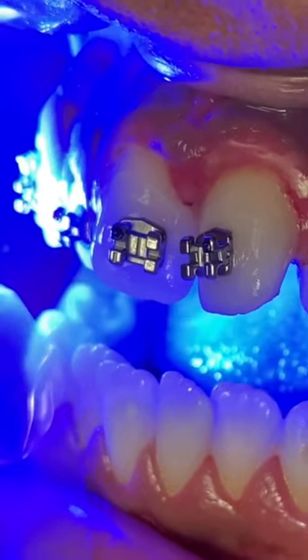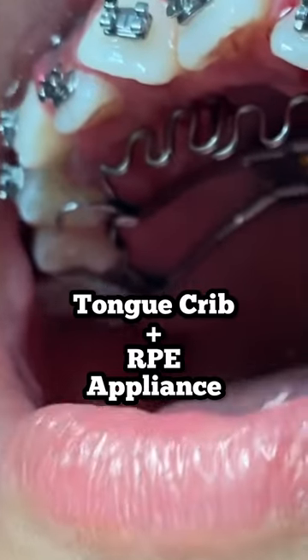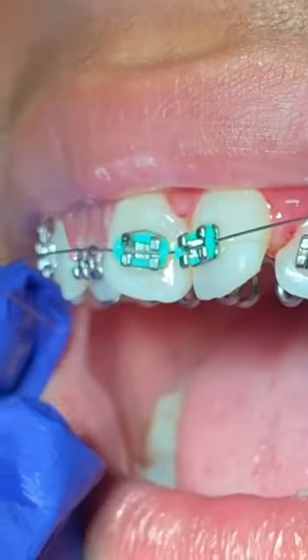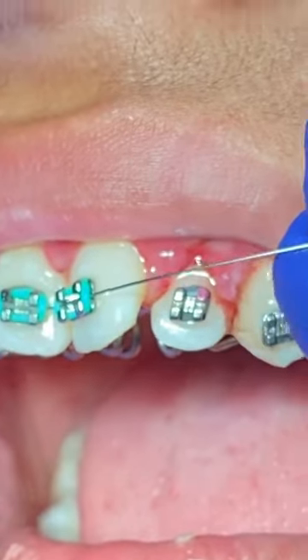You can see here we bonded it, and then we're curing it with our curing light. Then we put the wire and we're putting on the colors.